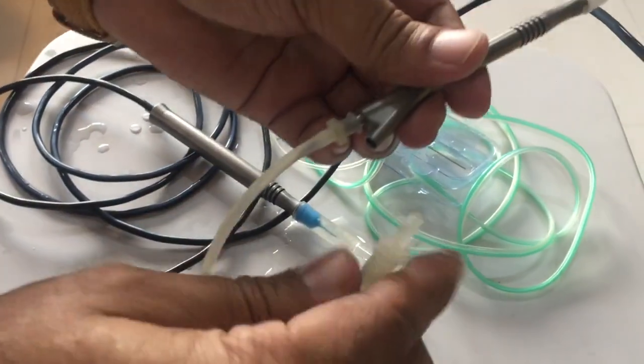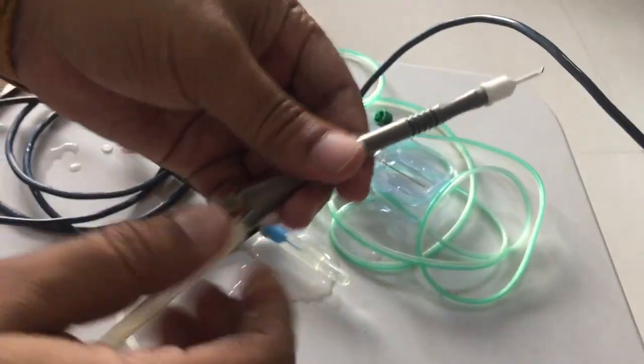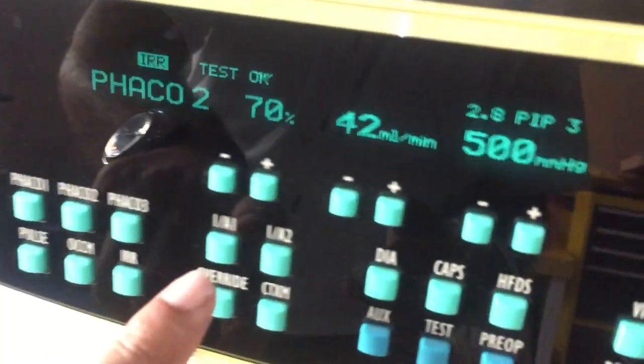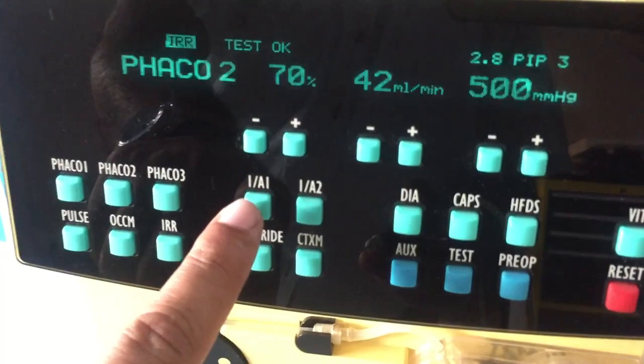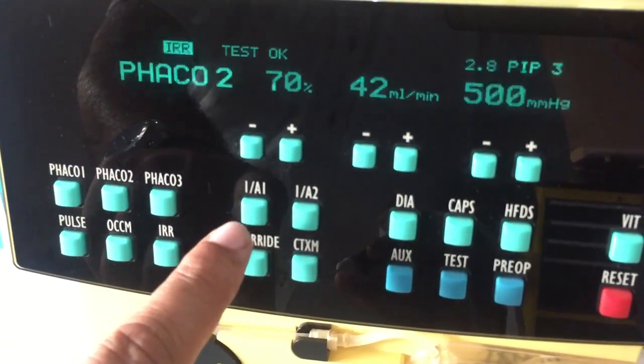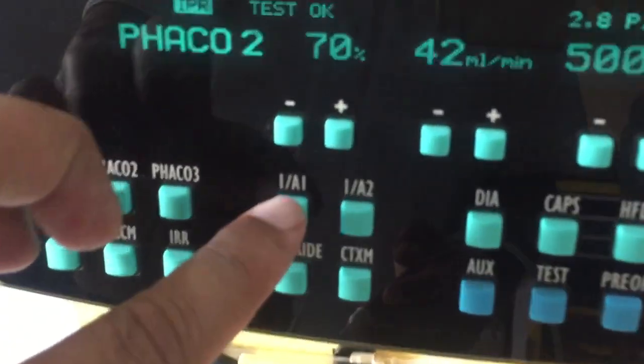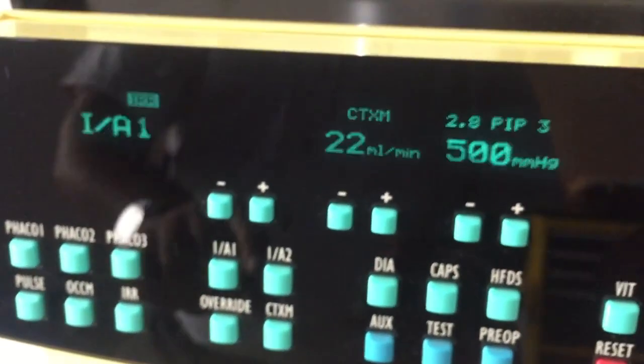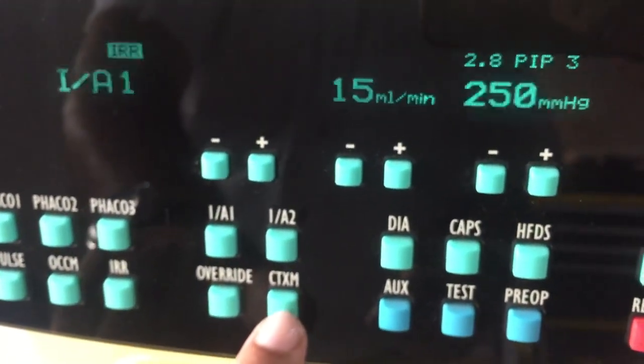reconnect it with the I&A handpiece of the machine. Then here is the option to select the I&A mode. So for I&A mode, you can press the I&A mode button here, and here is the CTX button.